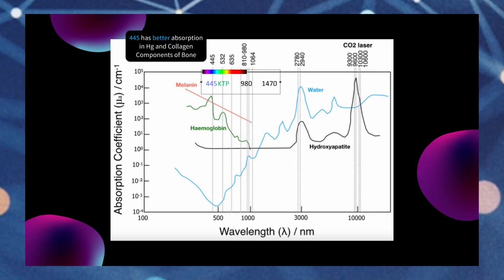So it's superior in that aspect. And what that does is it's about 30 to 40 times better absorbed in hemoglobin. So it limits its rate of penetration. So it's a little less complete as it goes right through the footplates. And that's what you want. You want a controlled burn. So it is superior in that aspect. And there's also some benefits in its heat spread pattern.